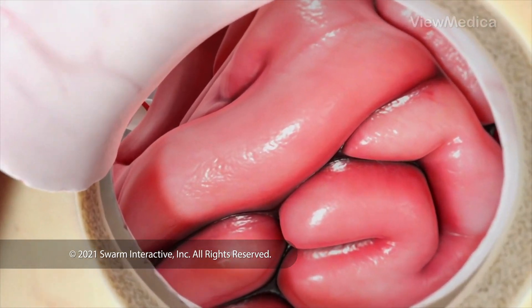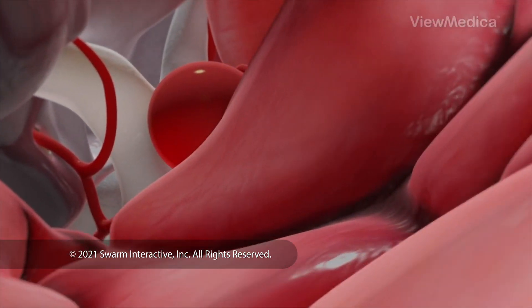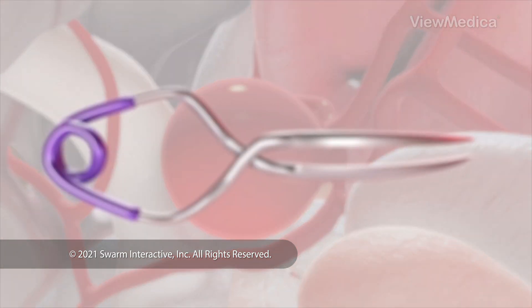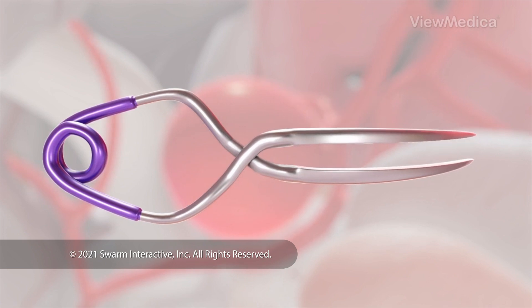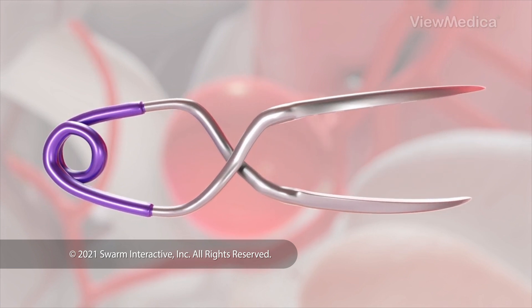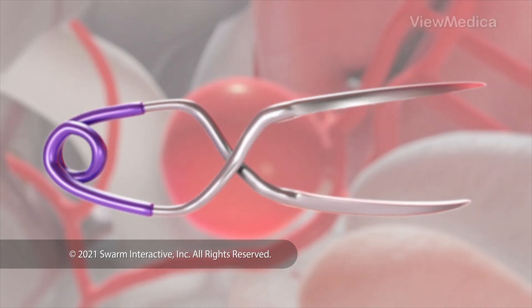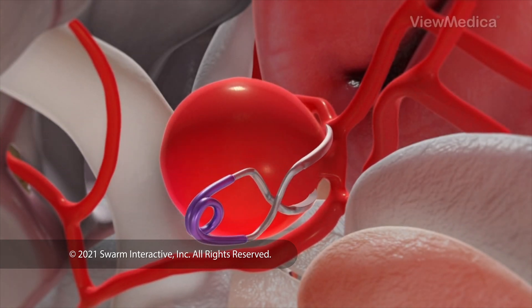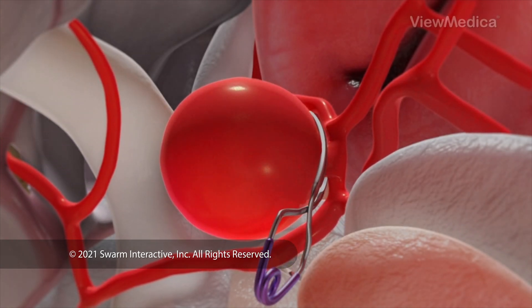We carefully move aside tissue to expose the aneurysm. Now it's time to clip the bulging artery. We use a small metal clip that opens when it's squeezed like a clothespin. We attach it to the base of the bulge, blocking the flow of blood into it. We may use more than one clip.